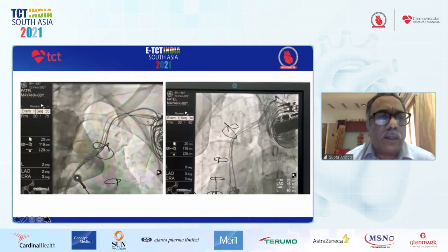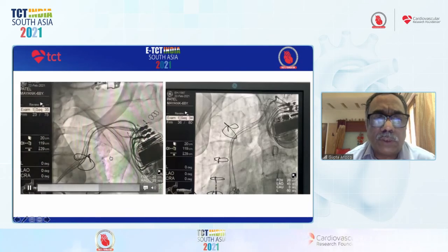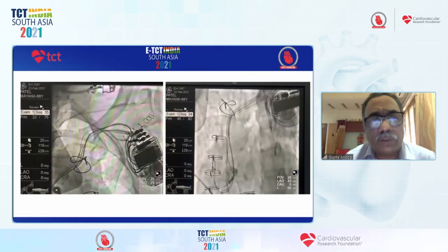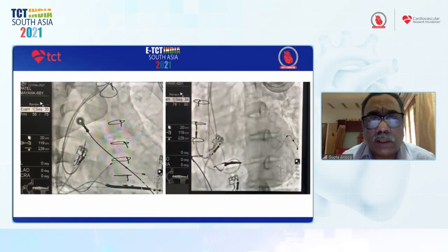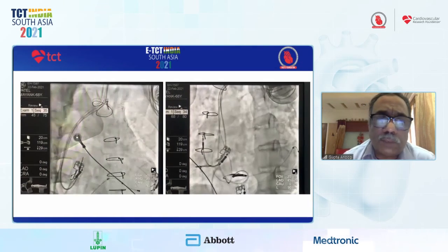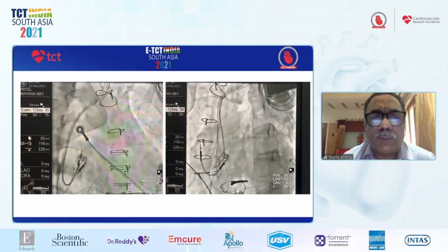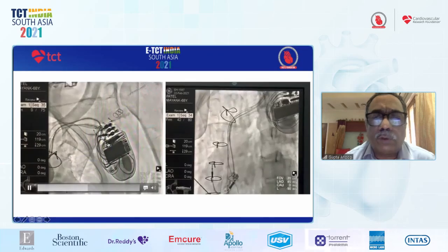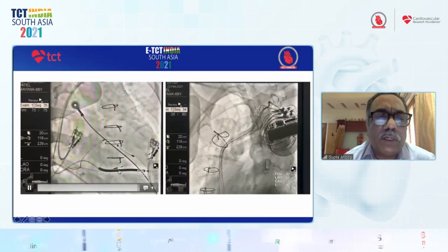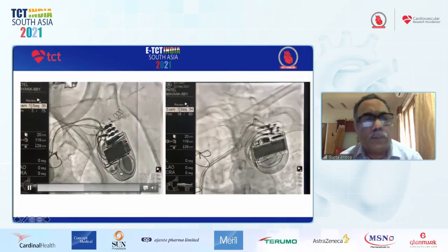Sometimes more than that, again, this was a patient in which the QLV on table was 160. So we thought this was a right bundle, left axis with trifascicular block. The indication of device was that the patient had multiple episodes of syncope post CABG. So obviously the patient was a candidate for dual chamber ICD. We thought about putting a CRT-D, but after putting the LV lead also, the QRS was not getting narrowed. So we decided to put an additional left bundle lead. So we did a CRT-D with the left bundle. The QRS became very narrow, and this patient also improved remarkably.